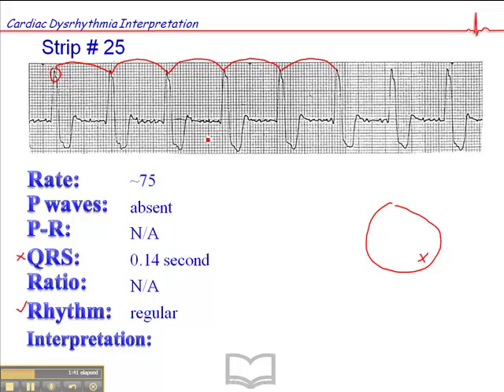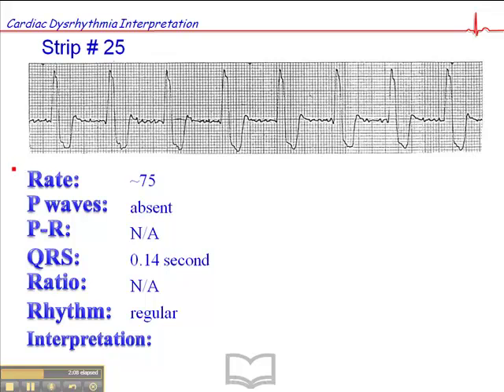You might also ask, could this be atrial flutter, given all of these things that appear to be — especially over here — possibly flutter waves? Again, the answer is no, because flutter waves have to be at least 4 millimeters apart, and these are about 1 to 2 millimeters apart. So this cannot possibly be atrial flutter, and that's a common misinterpretation of this particular rhythm.